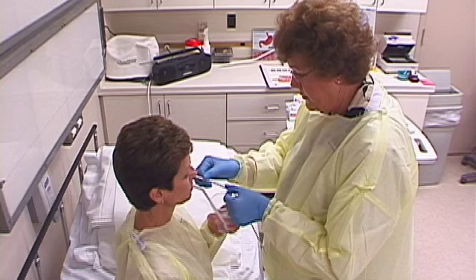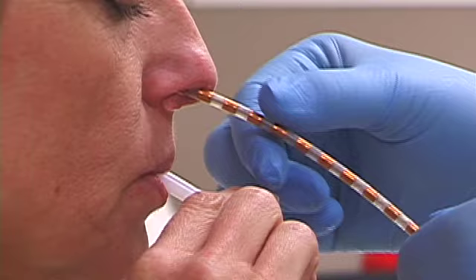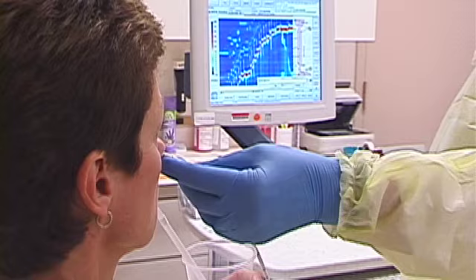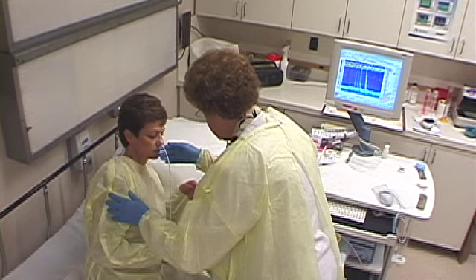The tube continues down the esophagus and into the stomach. A slight gagging reaction may occur, but it takes only about a minute to place the tube, and most patients quickly adjust. Small sips of water may be taken to aid the process. After insertion, a computer readout confirms the probe is in the correct position and the tube is stabilized in preparation for the swallow test.